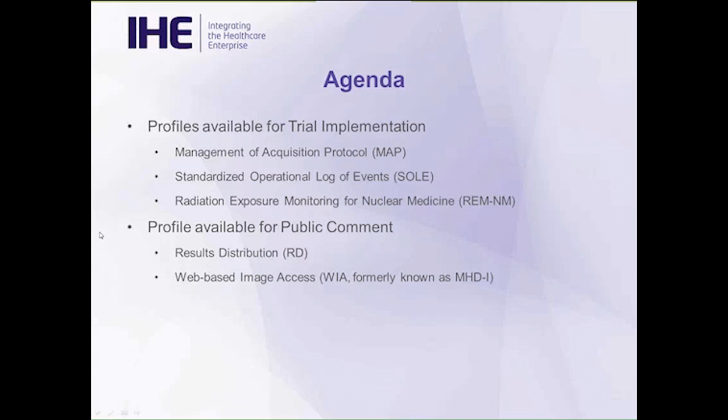And then the web-based image access, acronym WIA, formerly known as MHD-I. WIA provides for image sharing and interactive viewing of studies via RESTful services. And it supports different backends such as XDS and DICOM and DICOMweb.